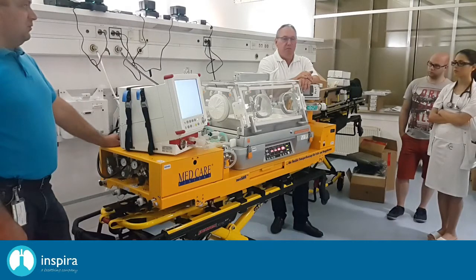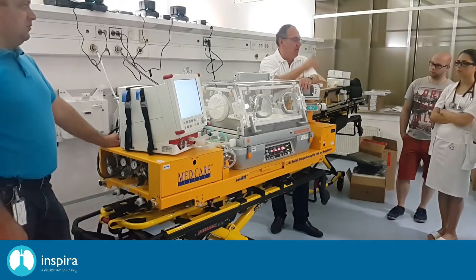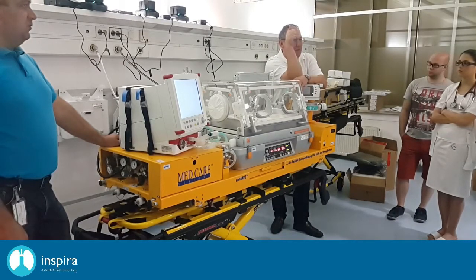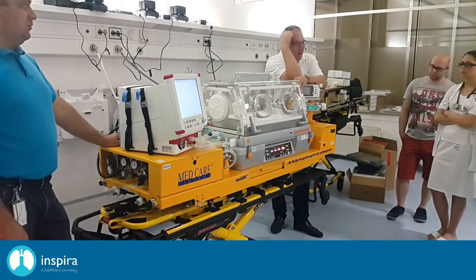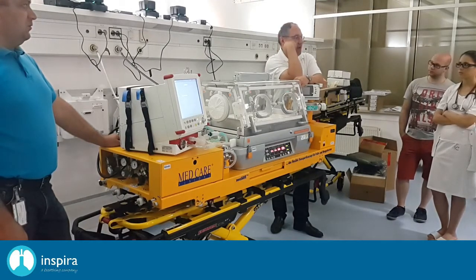Just a quick word on a basic situation. The intended usage for this transport system is to transport one baby, okay? I just want to make it clear because we frequently get the question, what are we doing with twins?